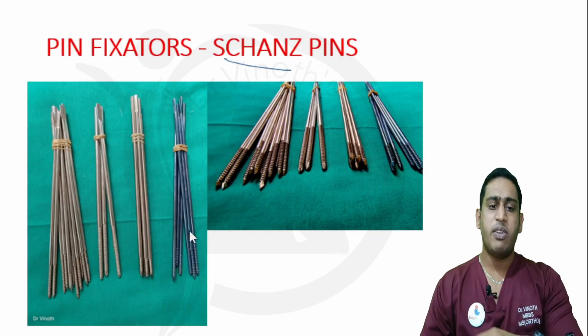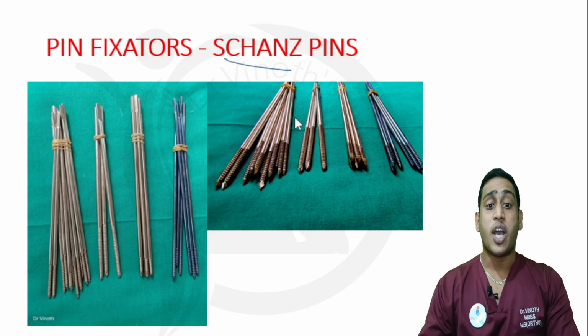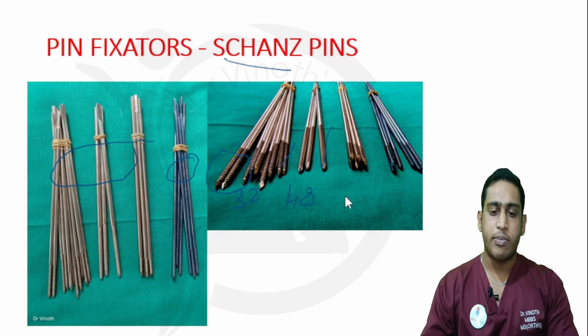In the pin fixators, they use a specific pin called SCHANZ pins. So this is a SCHANZ pin. These first three are made up of stainless steel, and this colored one is made up of titanium. As you can see, at the tip of the SCHANZ pin there are multiple threads, and there is a difference in the length of the thread. This is 32 mm threaded, this is 48 mm threaded, this is 16 millimeter threaded.